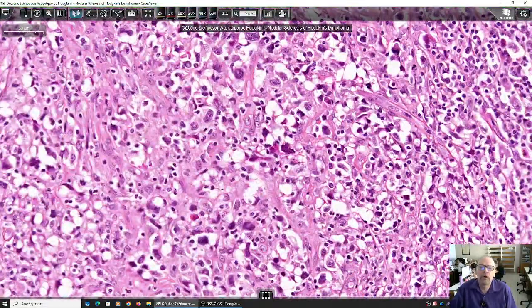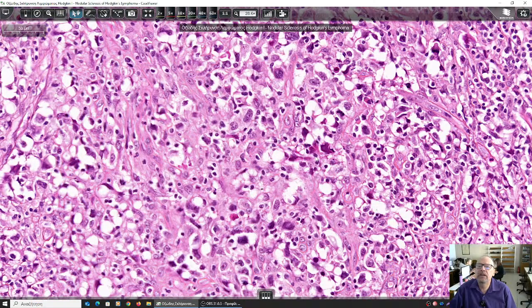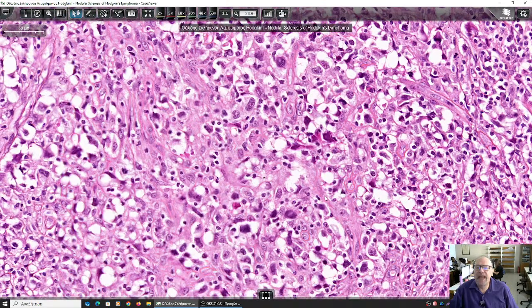Of course not. What is the hallmark of malignancy in this cell population within these nodules? How can you tell that these cells are malignant? What is the most evident sign that these cells are malignant? And they have nothing to do with the activated cells in the germinal centers. What is the hallmark of malignancy here? Yes, please. Yeah, pleomorphism. The nuclei are highly pleomorphic. So these are some neoplastic giant cells.